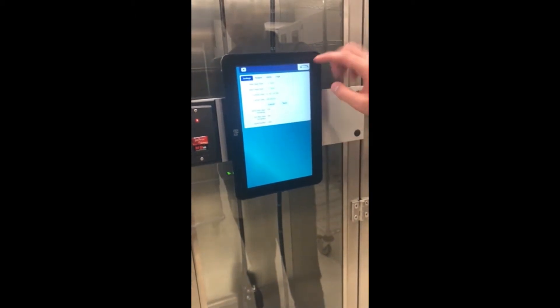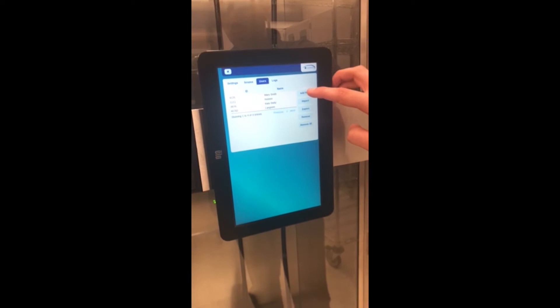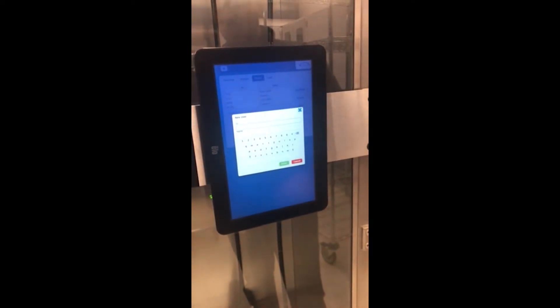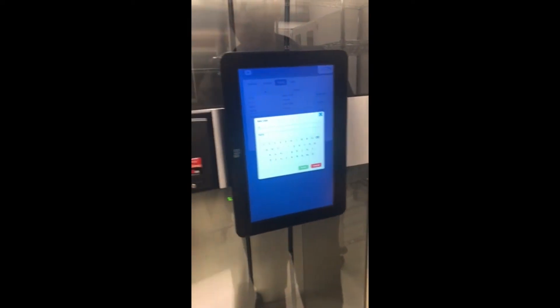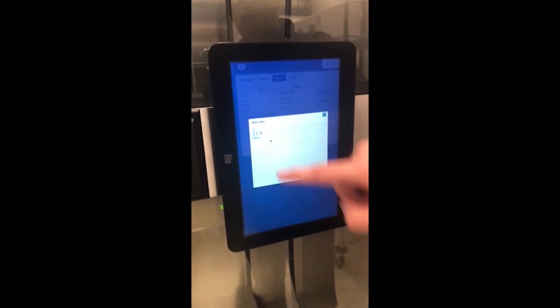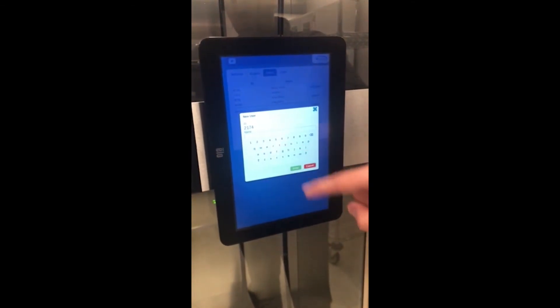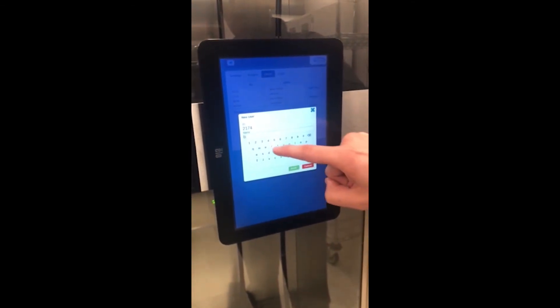You will press Users at the side. Here you will see Add New — select Add New. You scan the badge; it populates the name or the employee ID number, and then you would type in their name.